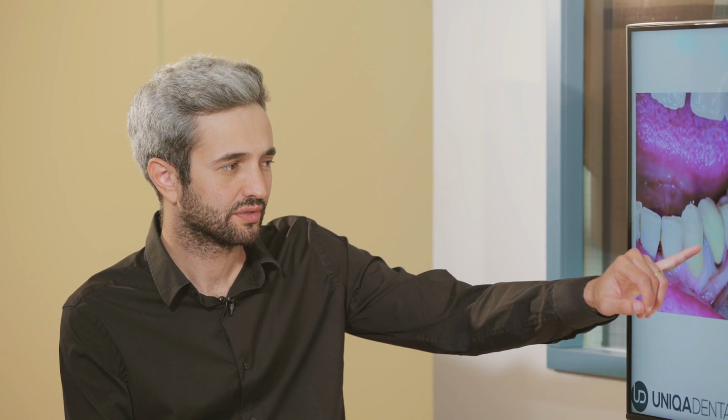Wait, this is a crown? Yeah, this was a crown. Because of the caries, you can just take it off, but you can see that you have a lesion, you have inflammation. You can't restore the tooth, you need to extract the tooth. So we extracted the tooth. There is not enough bone. The bone is too thin and we don't want to add an extra thin implant in this place.